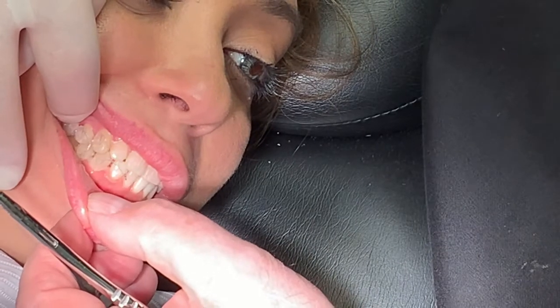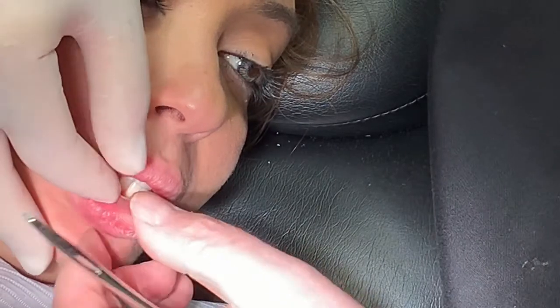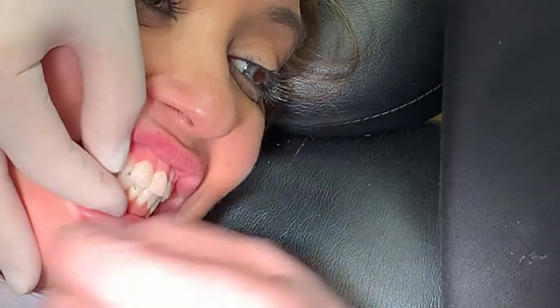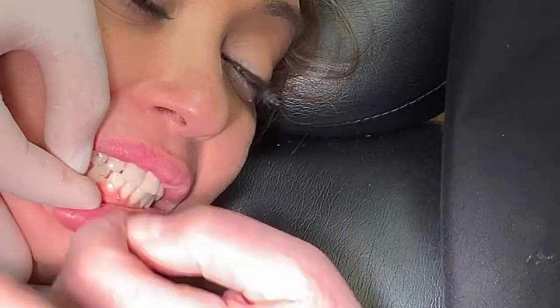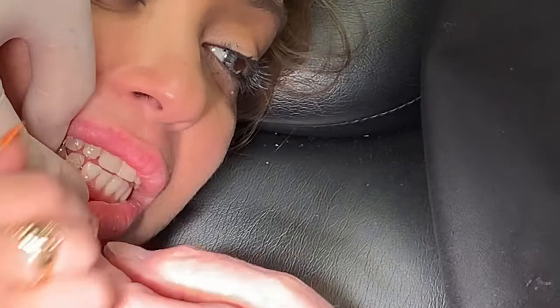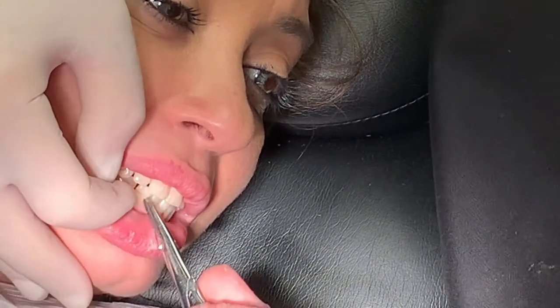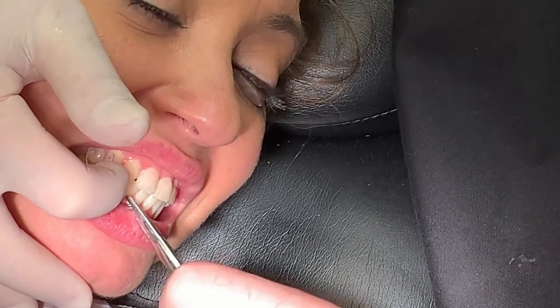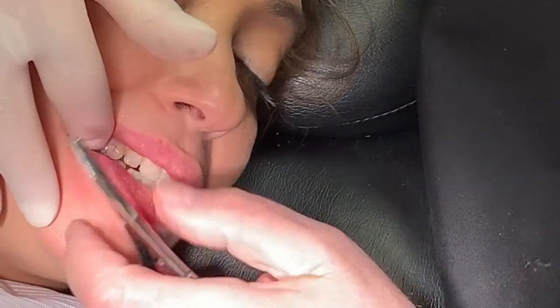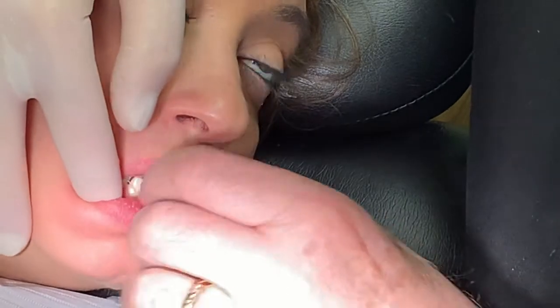If you think the wire will not come out of the brackets, you're good. At which point, you can then cut off the excess. You're going to cut off the excess and tuck the tail underneath. You could tighten it a little bit more, if you want me to. I don't want it to come out. Okay. Is that comfortable? Try speaking a little bit. Okay. Good. Then it's done.